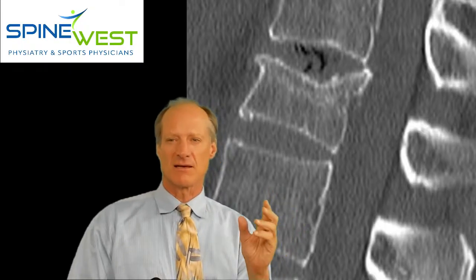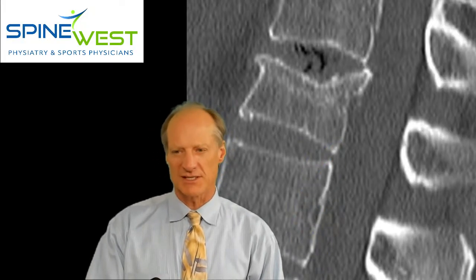The X-rays are absorbed by different density tissues, especially bones, and the X-rays pass through the soft tissues. So you don't see the soft tissues very well.